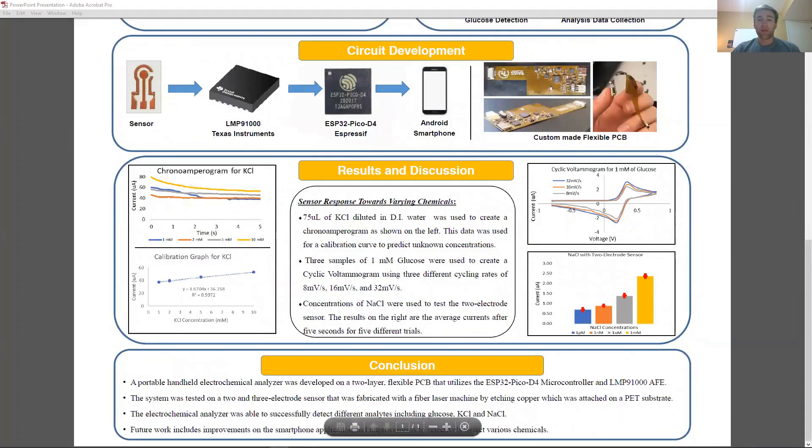A custom-made, flexible, two-layer PCB was designed and implemented. The system utilizes the LMP-91000 IC from Texas Instruments as the electrochemical sensing analog front end. This IC communicates with the microcontroller, which is the ESP32 Pico by Espressif. We chose this microcontroller because of its small size, its 12-bit ADC, low power consumption, and wireless capabilities.